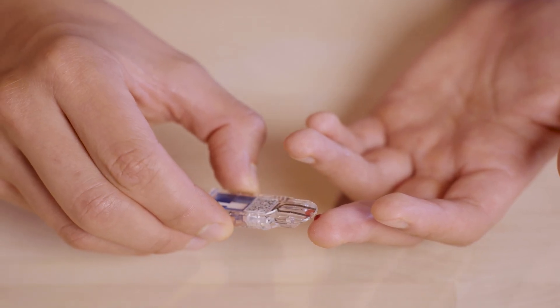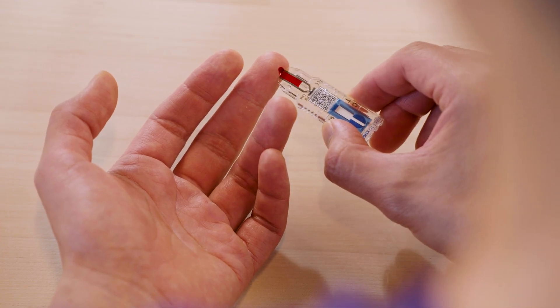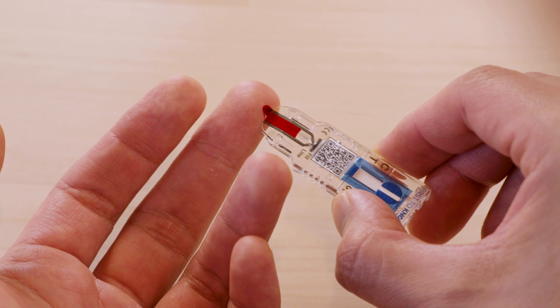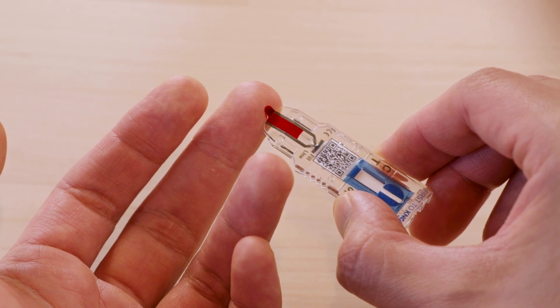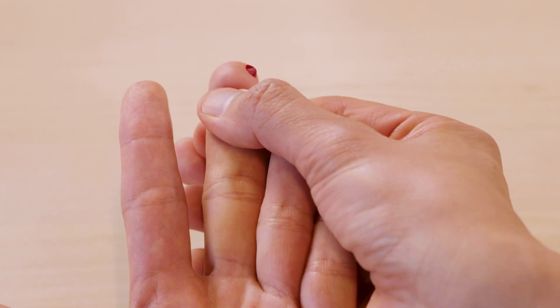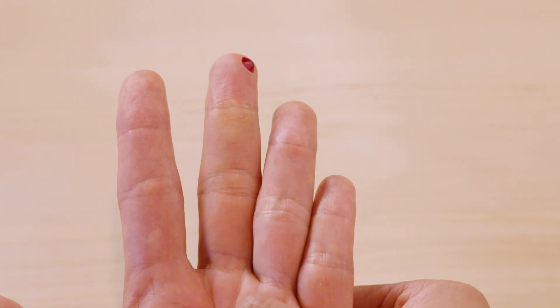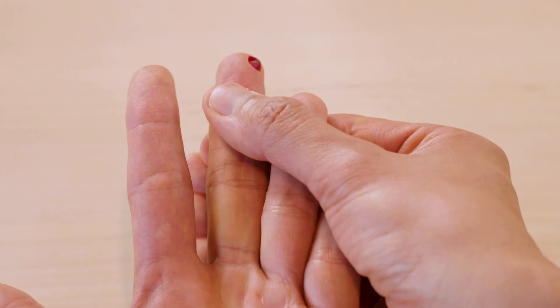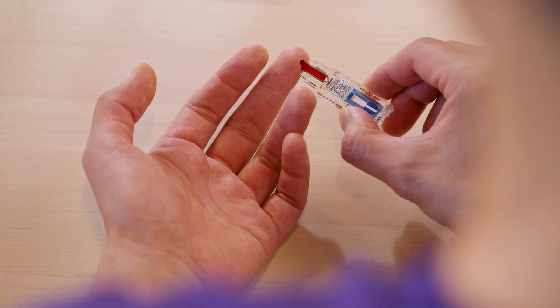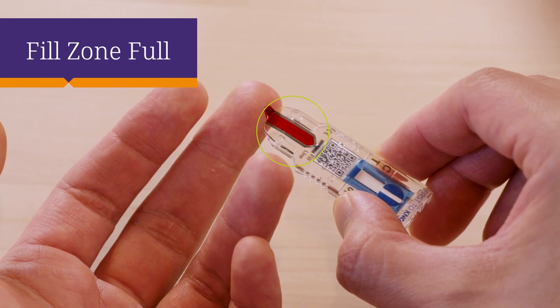Place the tip of the test to the blood drop in order to collect the sample. Touch one to three drops of blood to the sample application zone until the fill zone is full. If you can, stand up and hang your hand below your arm for better blood flow. If the amount of blood is not enough to completely fill the fill zone, repeat the palm massage to the side of the puncture. Squeeze the base of the fingertip again to form a new drop of blood. Then bring the tip of the device close to load the new drop. The sample fill zone must be completely full.